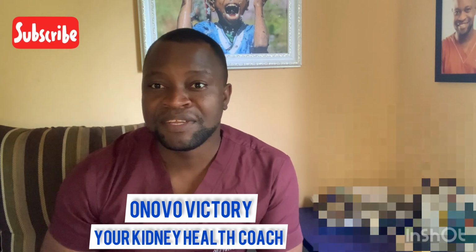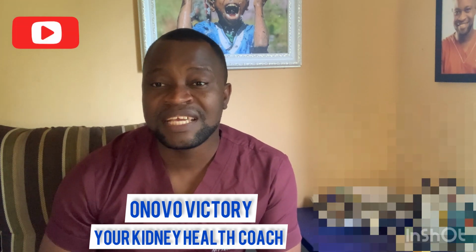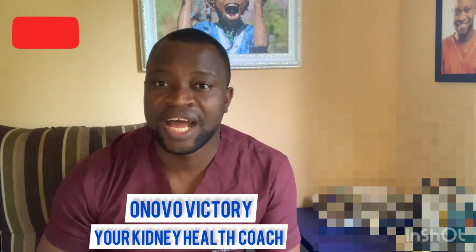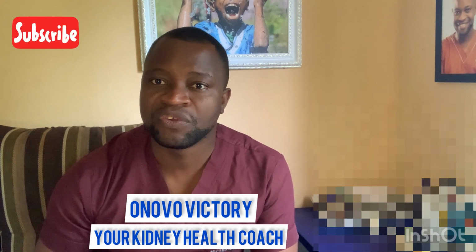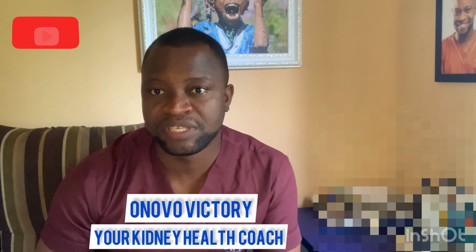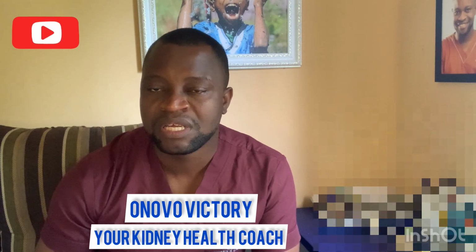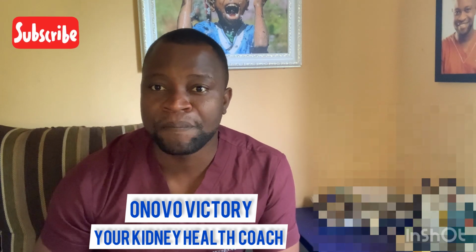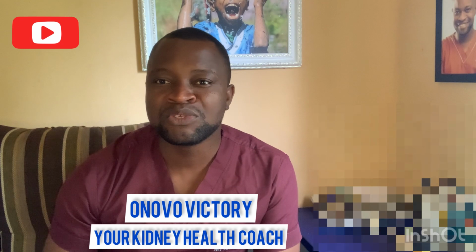When you've determined and known all this, the next thing you need to do is that you don't just check your sugar level and trash it. You have to keep a track record of your sugar level. That's number 2. Your doctor, or whoever is in charge of your care, your nurse, needs to know what you've been getting all this while, so that they will be able to compare it with the one we will get in the hospital.